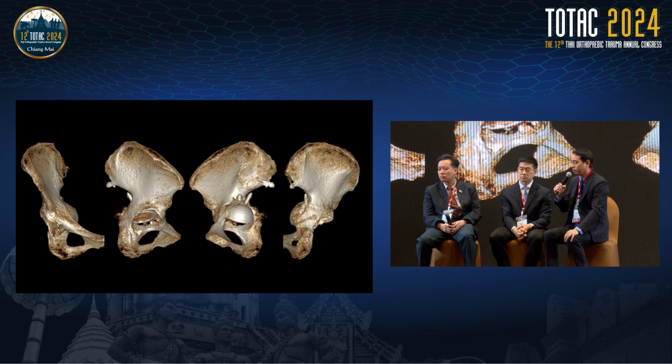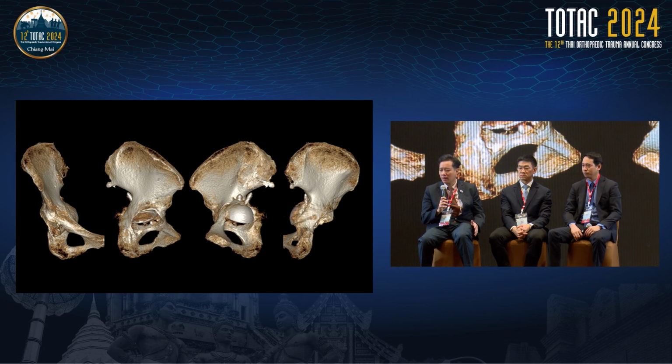And about the femur, there are fracture lines at the proximal and the distal, at the tip of the plate. Because the age of the patient is quite old, I prefer to use a standard cemented stem with a distal femoral locking plate from the distal along up to the tip of the GT. That's my opinion.